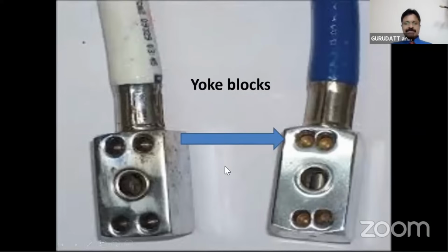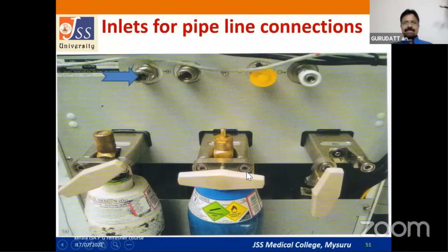And one question that is asked is about the pin index holes. Many times these yoke blocks will have pin index holes on either side. So they may ask you why pin index holes are made on either side, because the cylinder you cannot connect to the yoke upside down, but definitely you can invert these yoke blocks and then connect onto the machine. If you invert them and connect, and if there are no holes underneath the port, then definitely you can nullify the effect of the pin index safety system. So that's how the pin index holes have been made on both sides of the port, so that even if you invert and try to connect, you cannot nullify the effect of the pin index safety system.